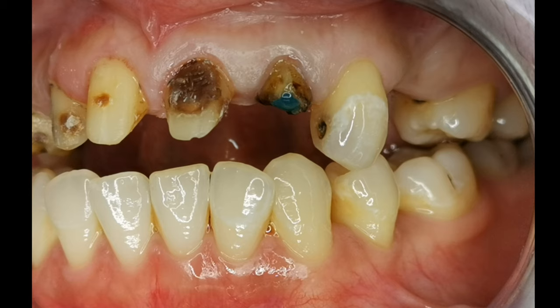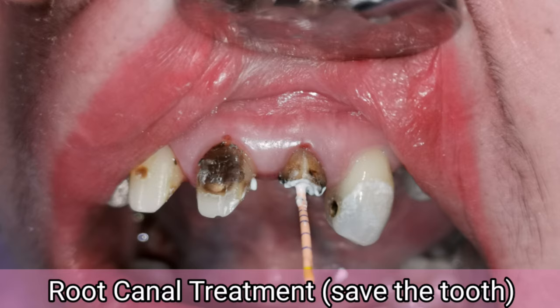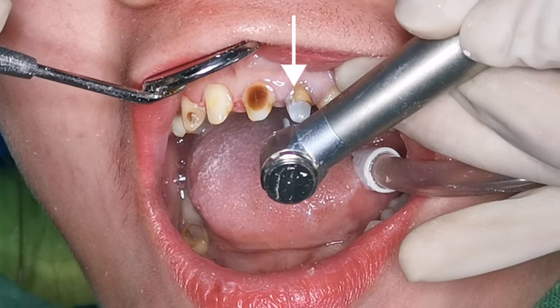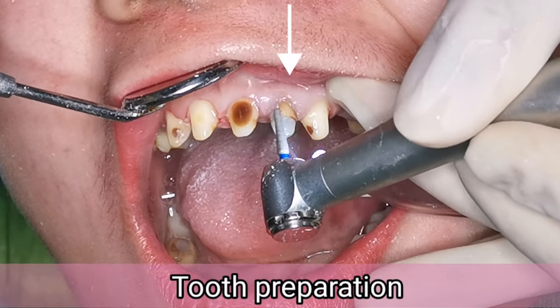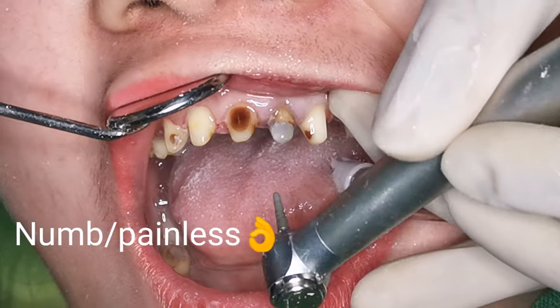When all of the dental crowns were removed, I found out that one tooth was badly broken. But instead of extraction, I did a root canal treatment, placed a dowel, and built up the core because there was not enough tooth structure to support the new crown. This method saved us time because had I extracted it, we would have had to wait for it to heal first, and the bone in that area would resorb or shrink.